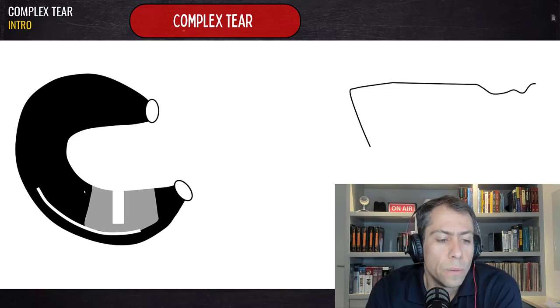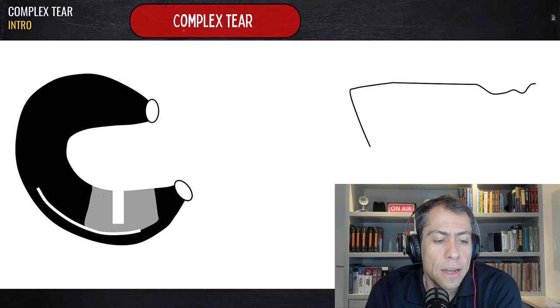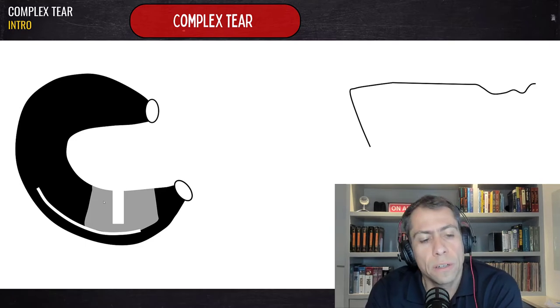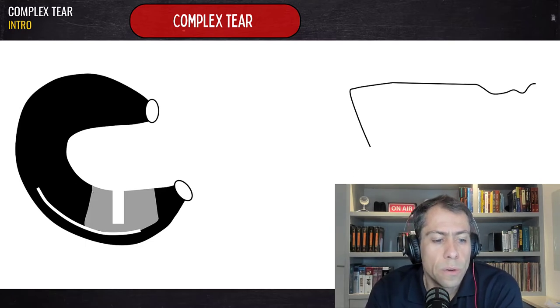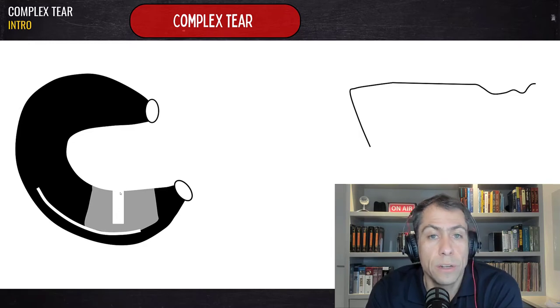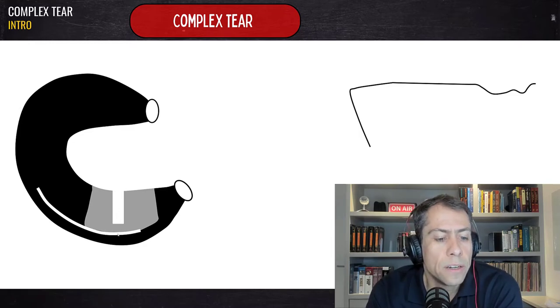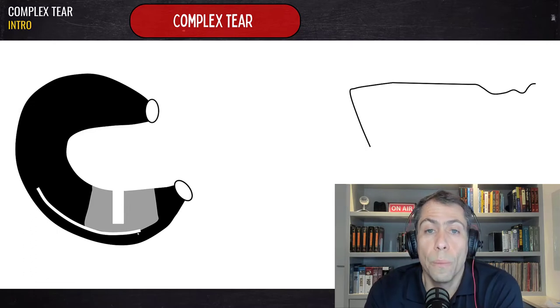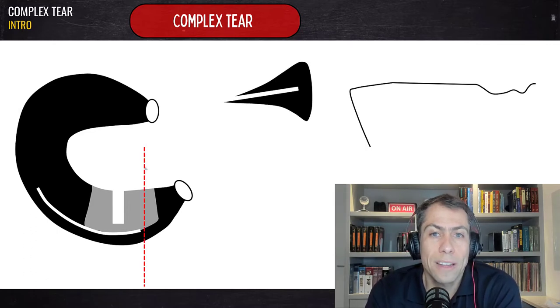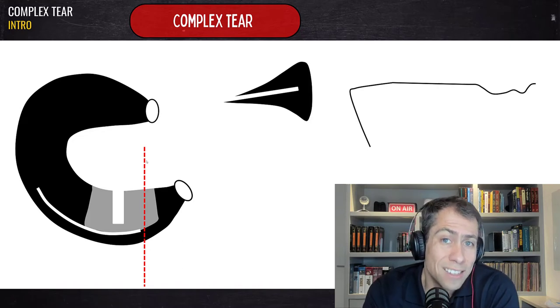For example, in this case we can see a complex tear at the posterior horn of the meniscus. Here is the horizontal component, here is the radial partial radial tear, and here is the vertical longitudinal component of this complex tear in the short axis — in this case the sagittal plane.